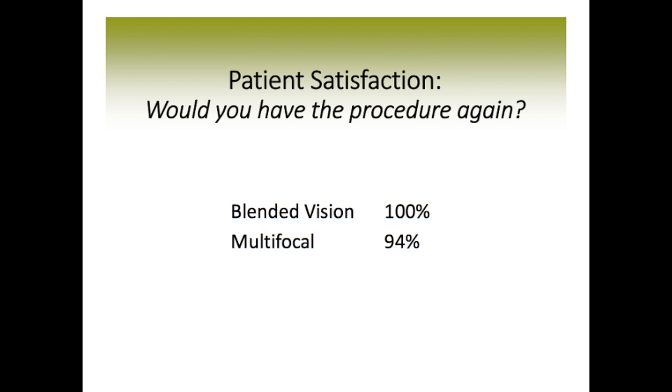But there are some problems with the multifocal IOL in the quality of vision, and because of that, we see that only 94% of patients are fully satisfied with the multifocal lens. When we ask, would you have the procedure again, it's 94%, but with blended vision, 100%.